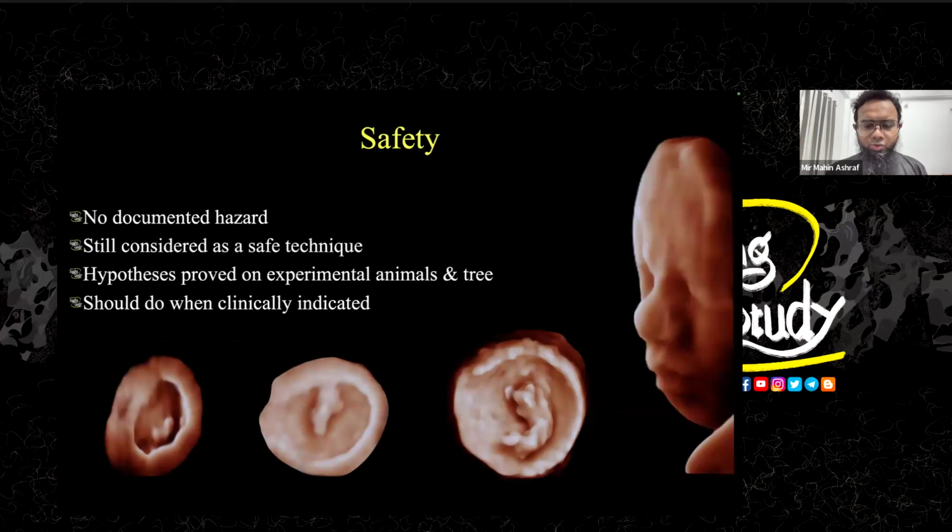Okay, so lastly, we are going to end our session with the safety and machine orientation.